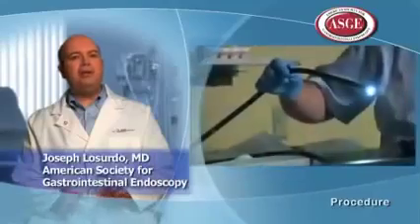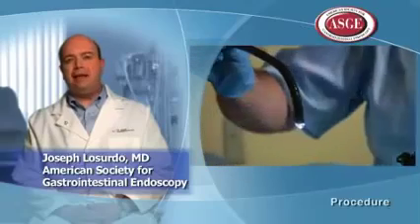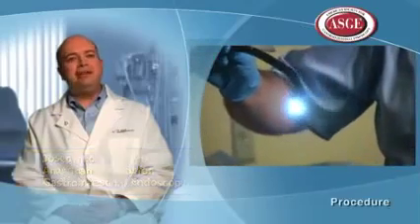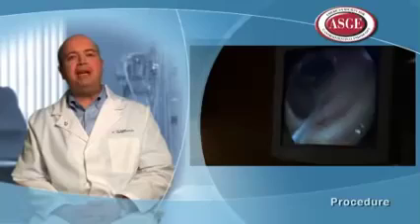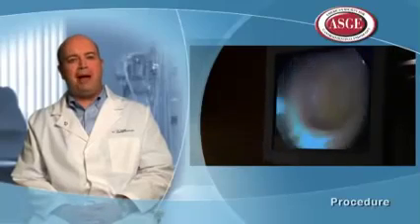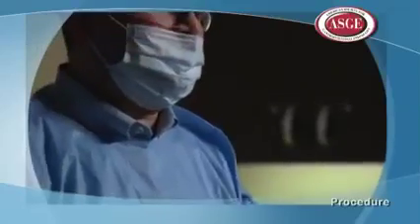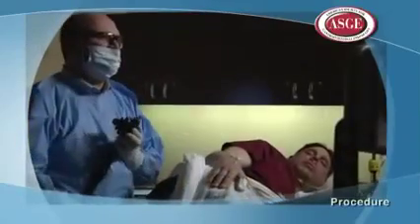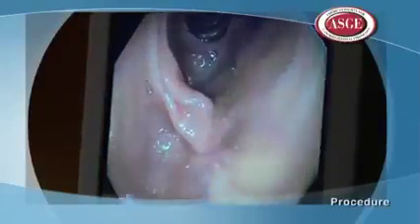The scope we use is a flexible tube that has a camera and a light source on the end. In addition, there is a channel that allows us to pass our instrument through the scope if we need to take a biopsy or take a polyp off. The scope does have dials, which allow us to move it left, right, up, and down so that we can guide it through the colon. The scope is inserted into the rectum after we do a rectal exam and then passed all the way to the cecum, which is the beginning of the colon.